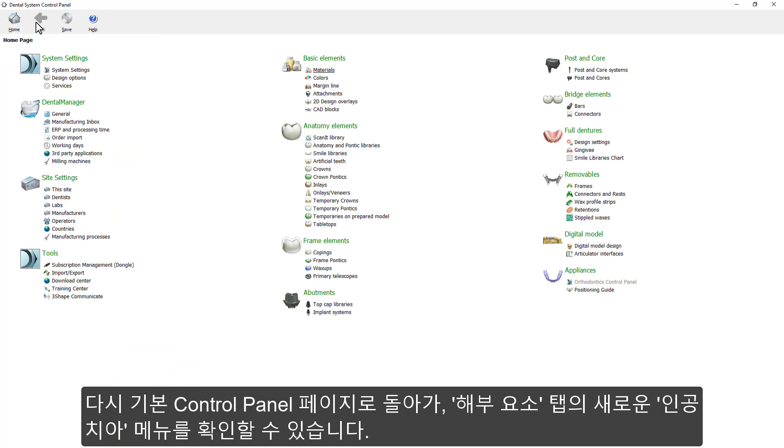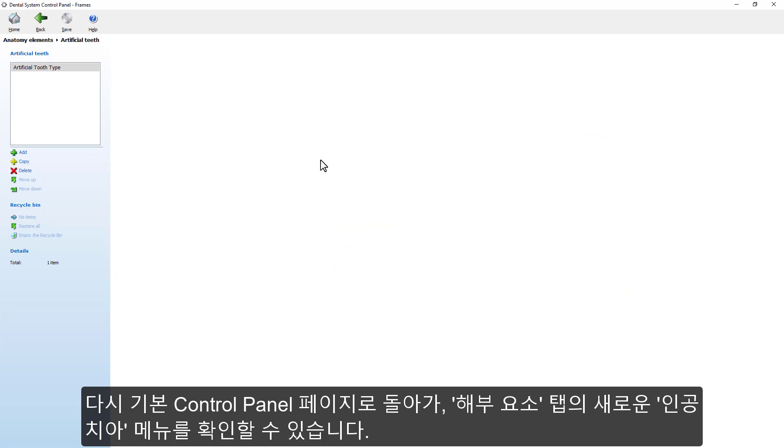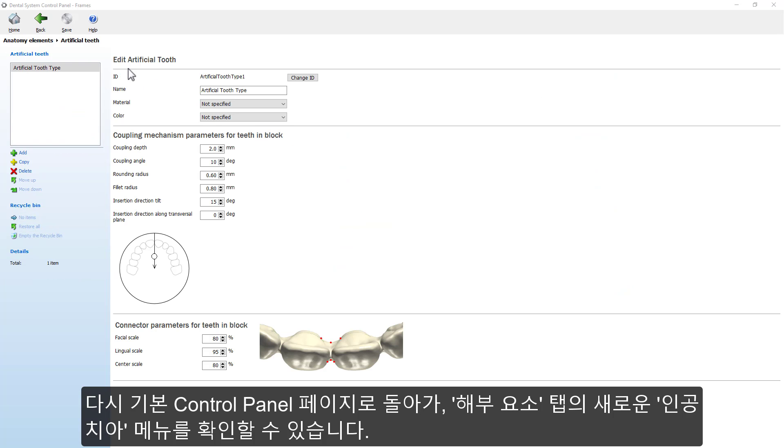Going back to the main control panel page, in the Anatomy Elements, you will have a new Artificial Teeth page.